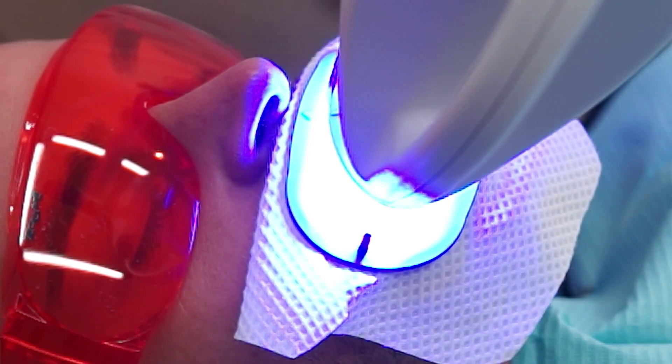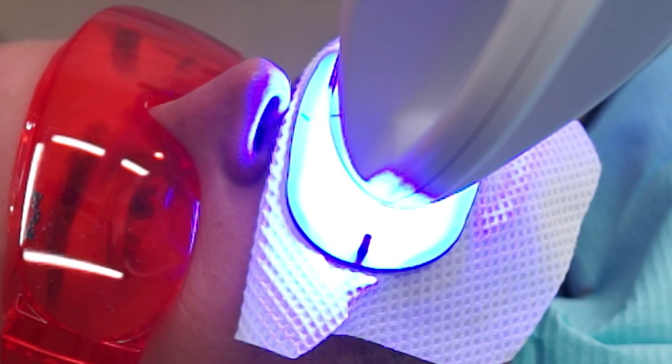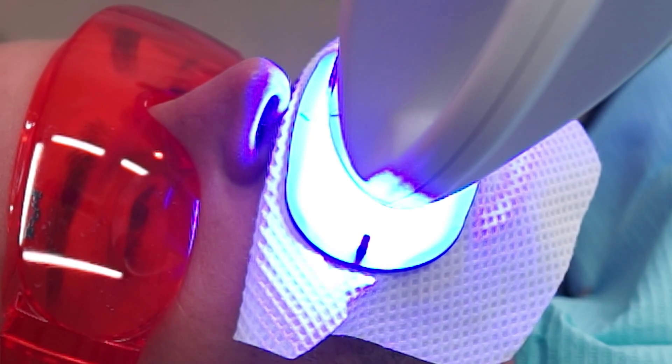In order to activate the whitening procedure, a light source is added which activates the gel. The cycles of the light are about 15 minutes each, in between which the gel is replaced.